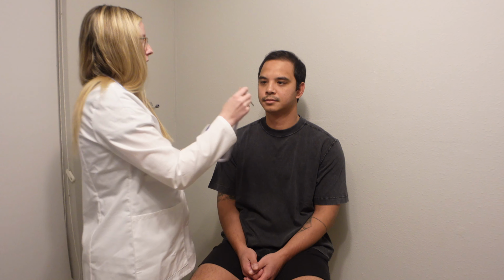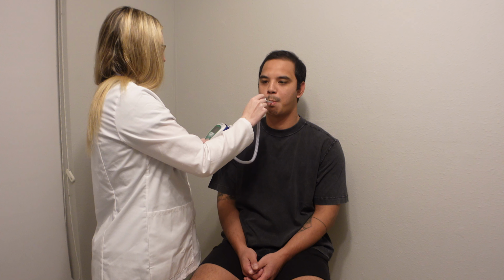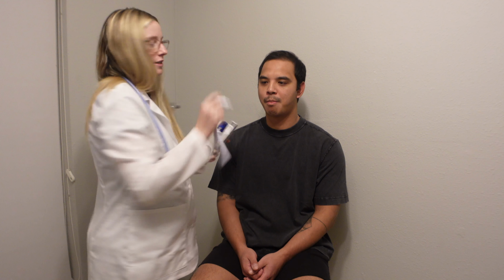So we'll first just get a temperature. Is that under your tongue? Under, yeah. Excellent. 37. And then I will get a blood pressure.